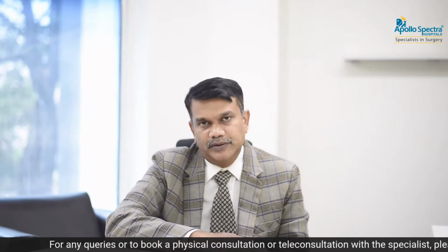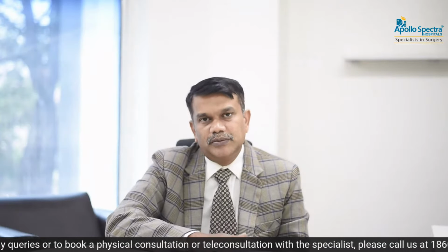So Lee Blanc in 1993 introduced the technique for laparoscopic ventral hernia management that's called IPOM. The full form is intraperitoneal onlay mesh repair. So that is a standard of treatment. Now recently we have developed the IPOM Plus. What is IPOM Plus? It's intraperitoneal onlay mesh repair associated with defect closure. That's why it's called IPOM Plus.